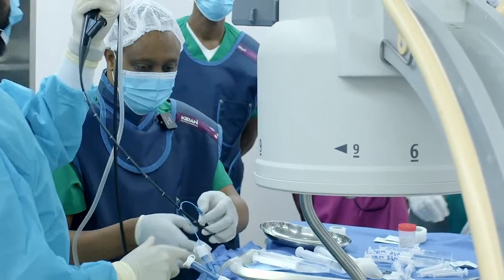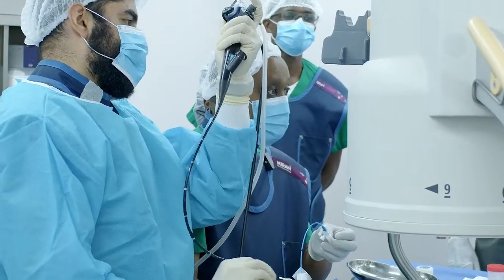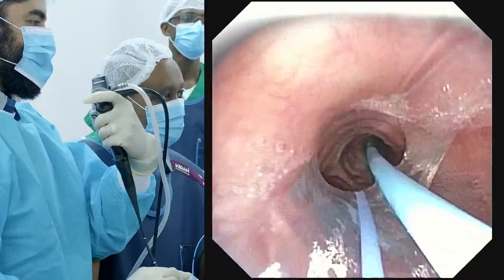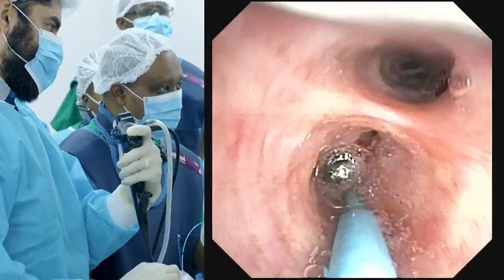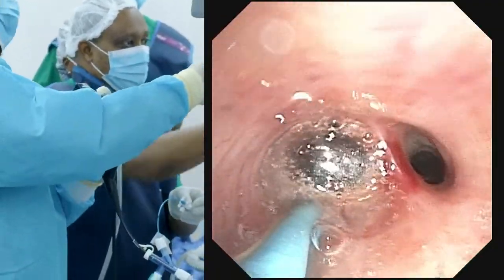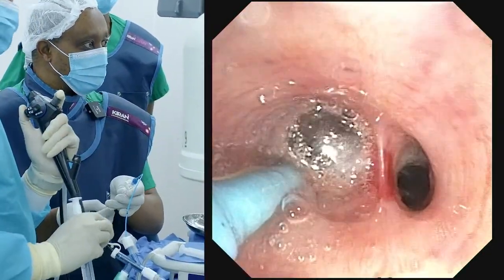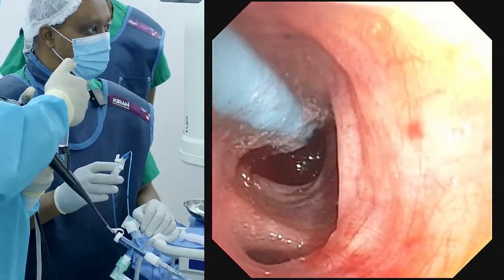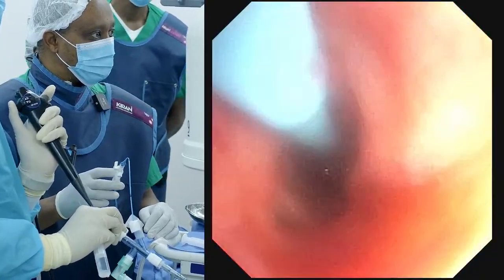Okay, so now step 2, we're going to check if there's any bleeding. We hope our balloon stayed in place, but so far it's okay. Clean. So far that place is not bleeding. If you look at that, that's the balloon there. It's inflated, the bronchus is blocked off. So now you can deflate it. And we check, and you see just a little bleeding, so usually. Okay, good. Alright, so cryoprobe.